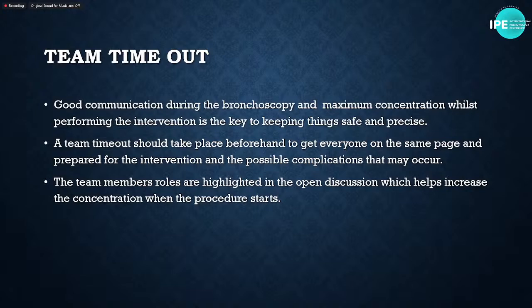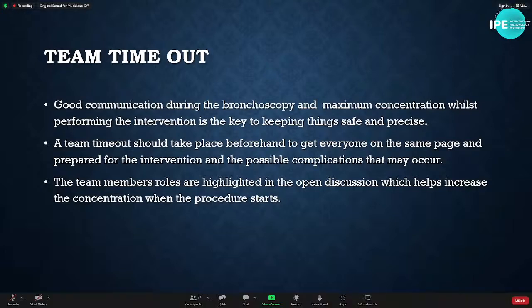We're going to do a biopsy in the right upper lobe. This and this could happen. This is your role. This is your role. This is how long we're going to take, so that everyone is on the same page as soon as the bronchoscopy starts. There are different studies on it. I'll show you a quick video of how we used to do it in my old clinic.